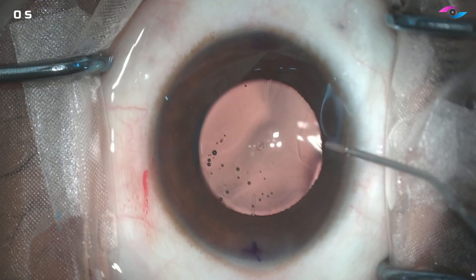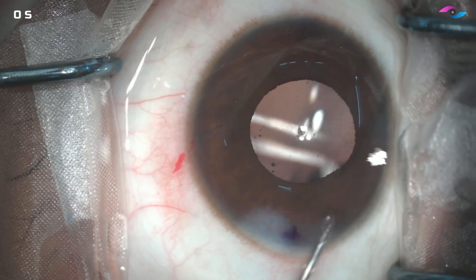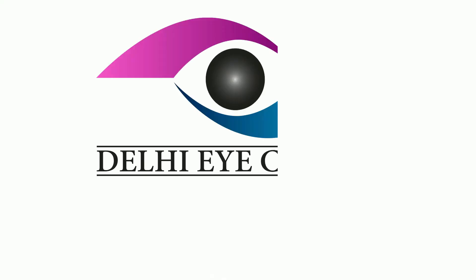Ensure a thorough wash — just keep it near the central hole and then wash off. We inject pilocarpine and then hydrate the wounds, and this is the end of the surgery. Thank you so much for watching.